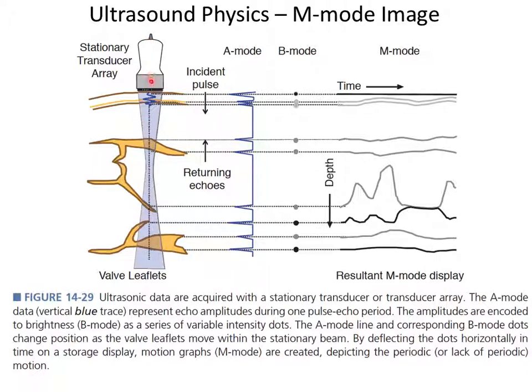So with our transducer here, if we look just along one line, down here we're going to get a reflection from this surface. So this will be the signal that in that 500 microseconds that we're listening, the signal amplitude we measure, if we plot it in time, looks like this, right? Where this is time. So we get a fast echo, 2 quick echoes here, echo, echo, some delay, echo, echo, echo, echo. Right? And so that's the time base of our signal that we're measuring. Is that clear? And so it's like a woo, woo, woo, woo. You hear these echoes coming back.